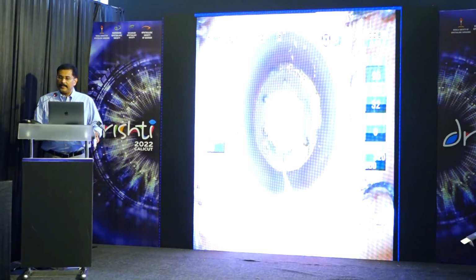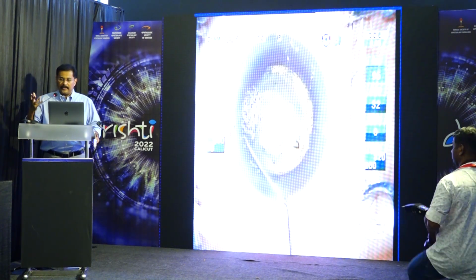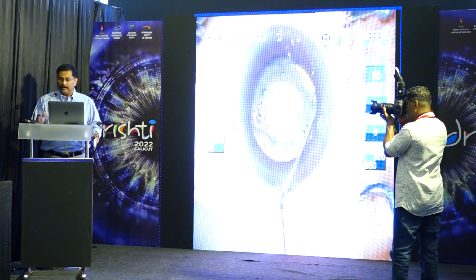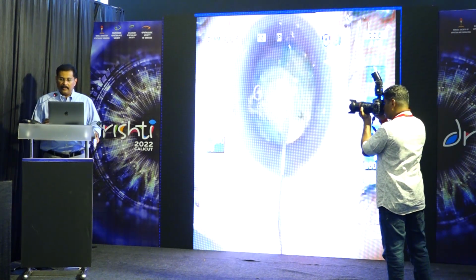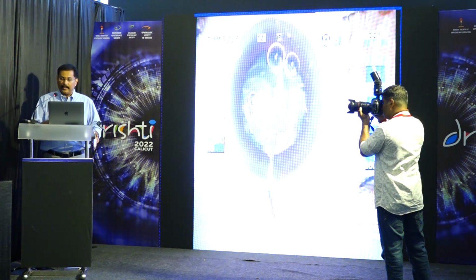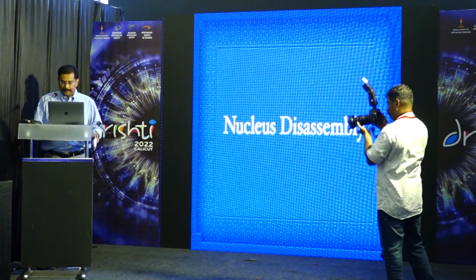So hydro procedure, many times it will be difficult to see because of the air bubbles inside, the fluid wave is not generally seen when there are a lot of air bubbles. But then we'll see the movement of the nucleus. You can just see the movement of the nucleus, and you can see rock the lens, and the air bubbles come out, and then your red glow is better. You can even repeat it.